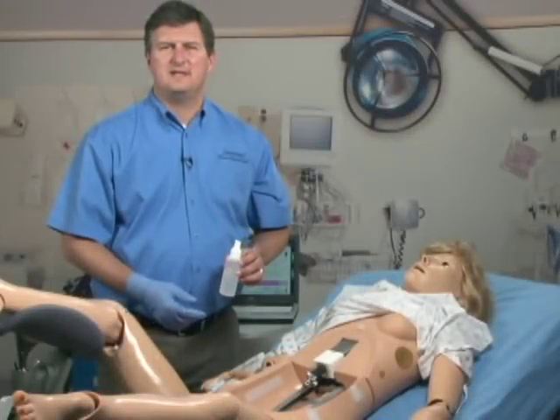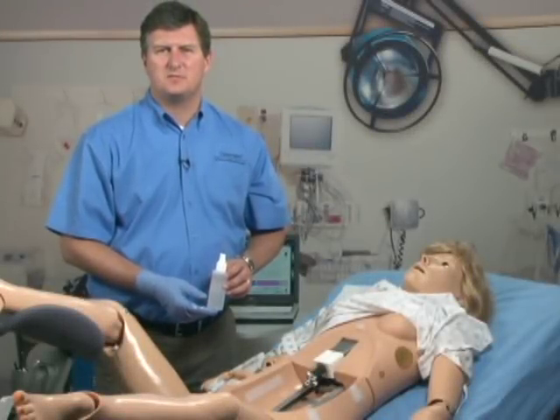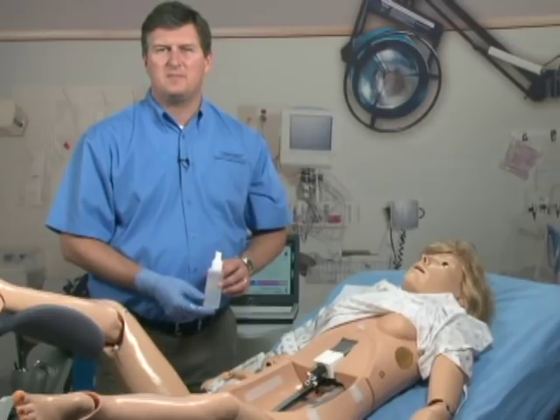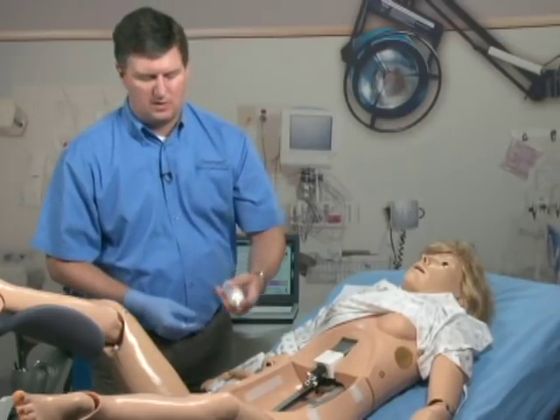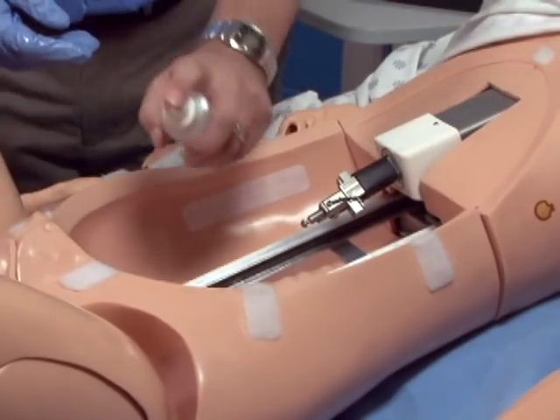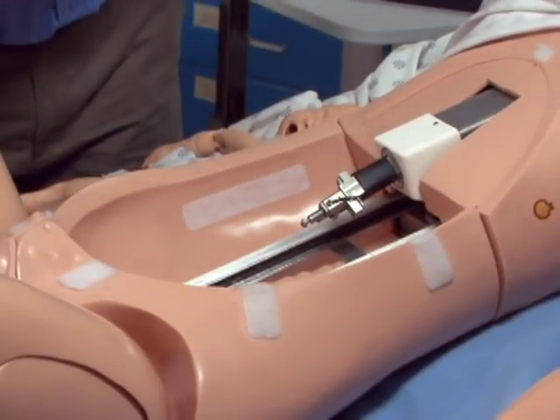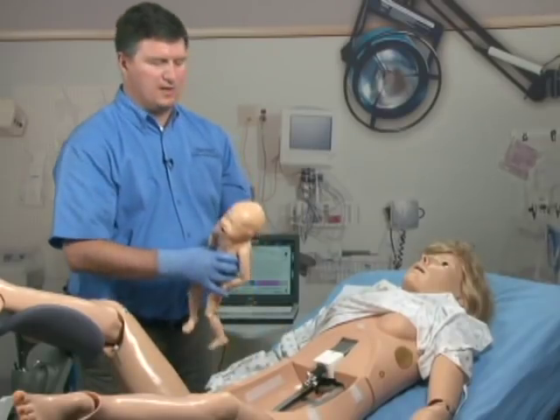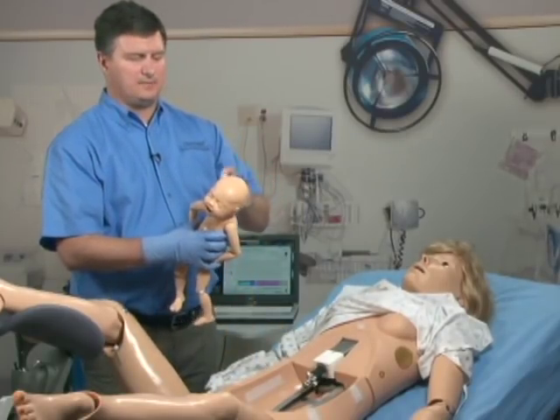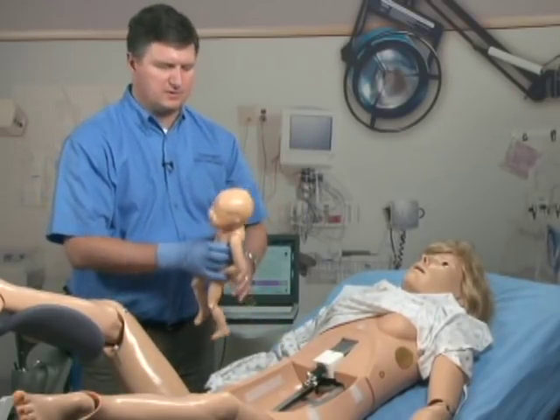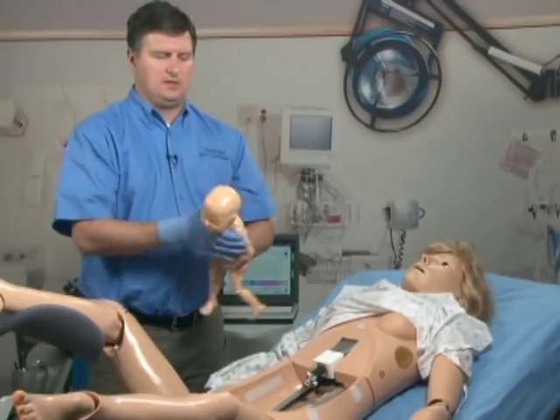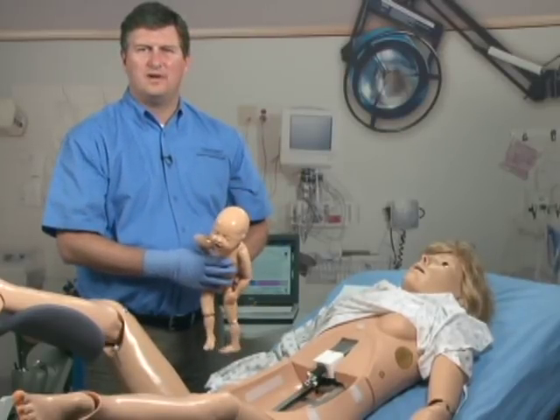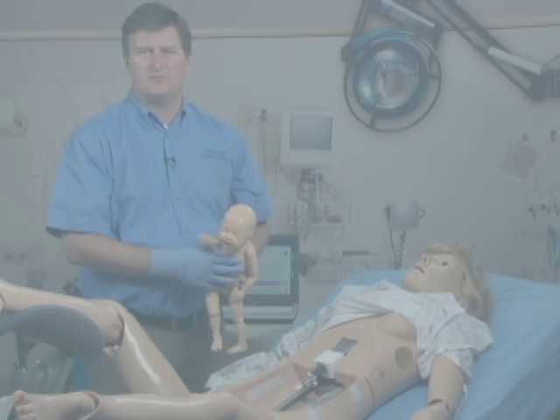Before attempting any delivery with the NOEL system, you must make sure that both the birth canal and the baby are fully lubricated. We spray the front, the rear, and the inside of the birth canal with the lubricant provided. Next, we lubricate the baby's head and shoulders and rub it around. We are now ready to insert the baby for delivery.